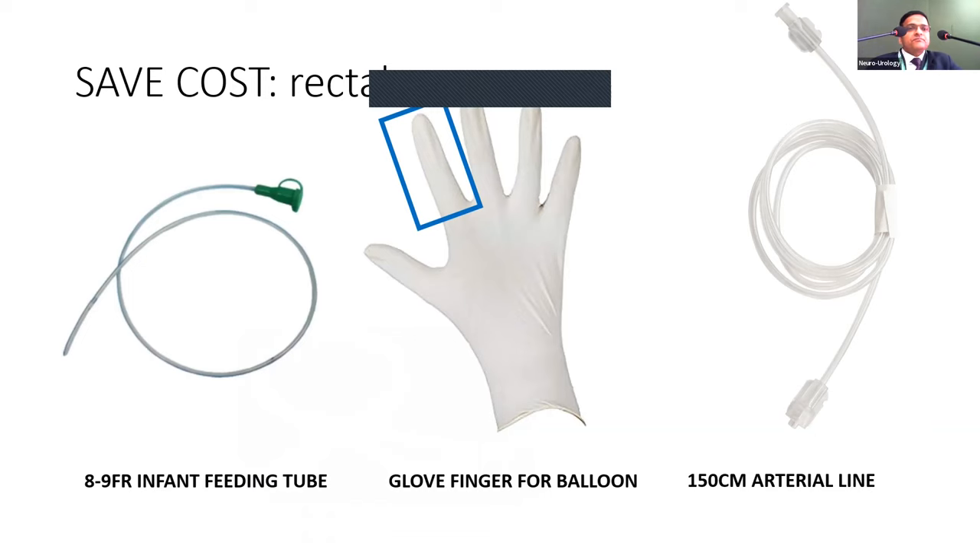Air-charged catheters are very rarely used in India due to their prohibitive cost. In the Middle East, we used them because you could simply discard a non-functioning one. While they are very convenient — no water mess, no need to zero to the superior border of the pubic symphysis — they are very expensive.